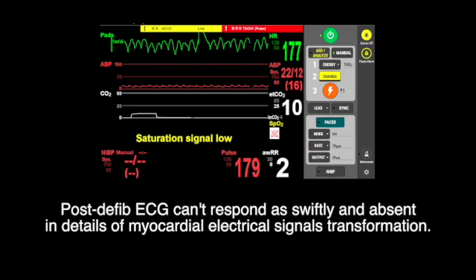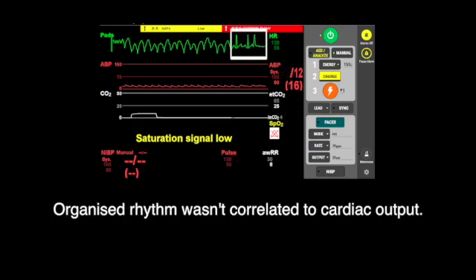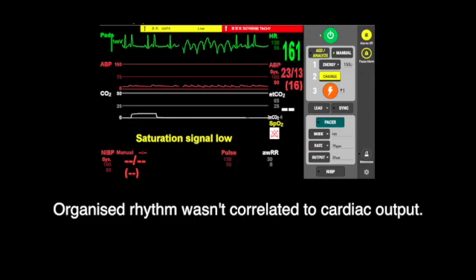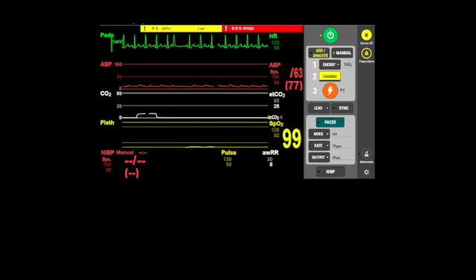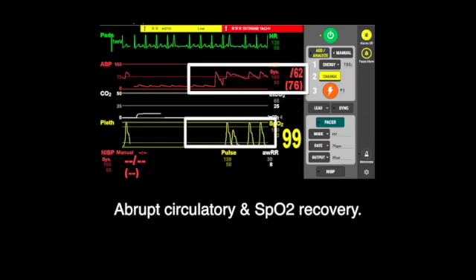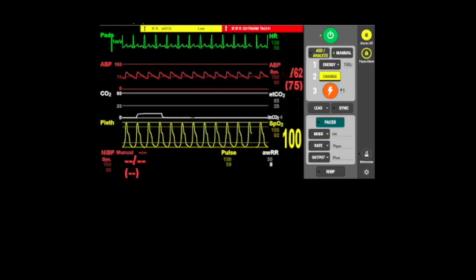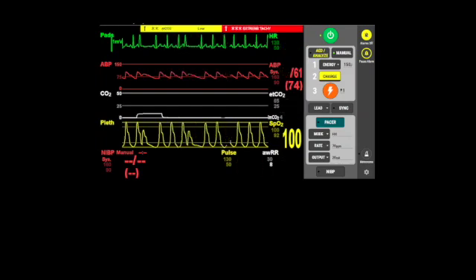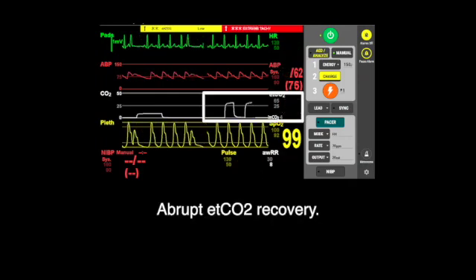Post-defibrillation ECG cannot respond as swiftly and is absent in the detail of myocardial electrical signal transformation. Organized rhythm was not correlated to cardiac output. There is an abrupt ETCO2 recovery.